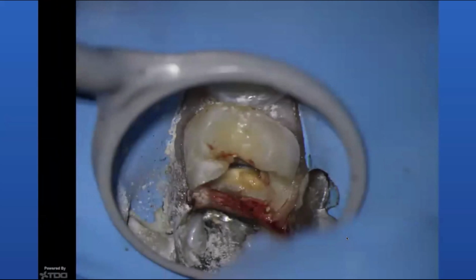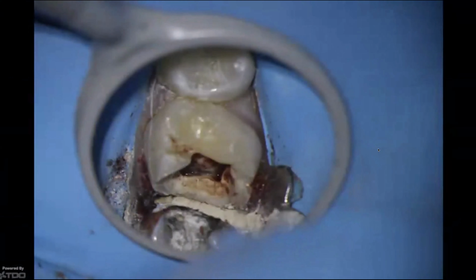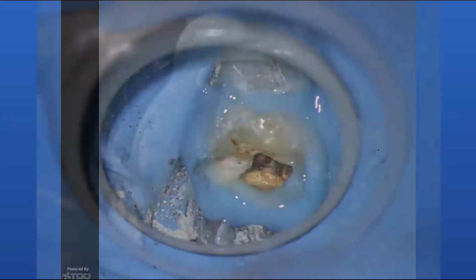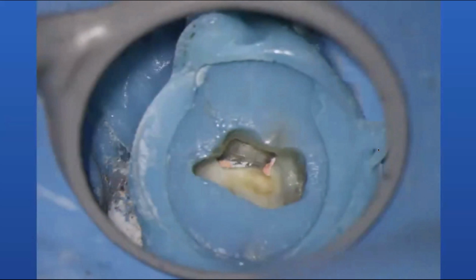So this is an example. We had interproximal decay. We performed the split dam. I was able to remove that band of tissue, so now it's somewhat hyperemic. I use the Cavit to block off that whole area and allow for me to have a nice clean margin to work with. Then I incrementally built up the wall, and then the entirety of the sound seal around the tooth to then be able to run the Gentlewave.